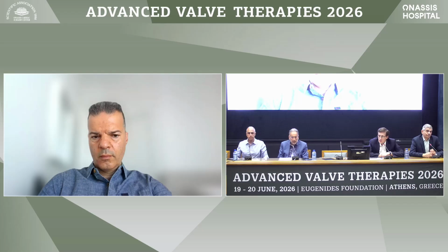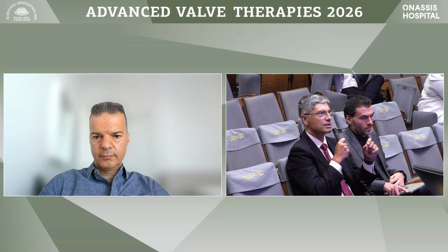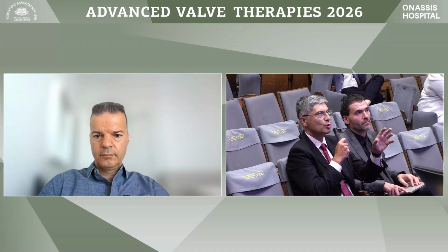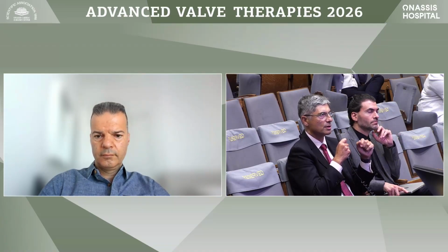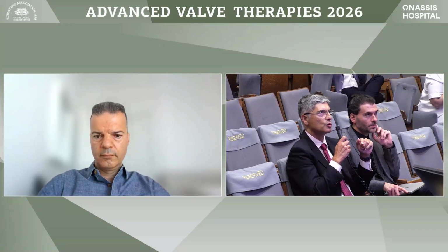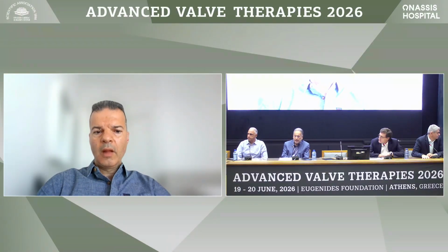So congratulations, Vlas. Thank you for being even remotely here. We enjoyed your presentation, and in regards to what Moni Shuvy just said now and before, is it advisable now that we should all aim, if anatomy permits, to go for clover technique, to have two grasps, in the anterior, posterior, anterior septal and posterior septal? Is it advisable? Vlas, is this a routine that you do, similar to Dr. Shuvy? Absolutely, 100%. And this is the modern way of performing TEER these days with both devices.